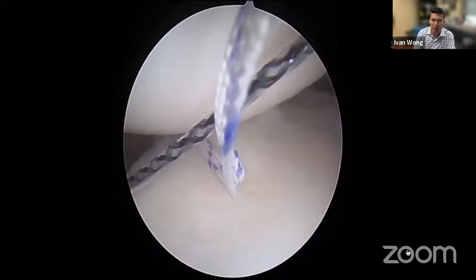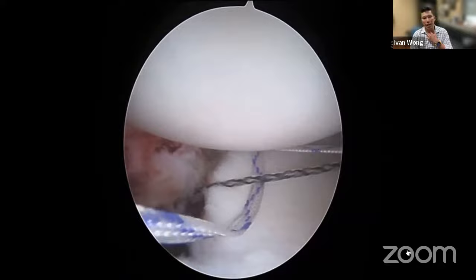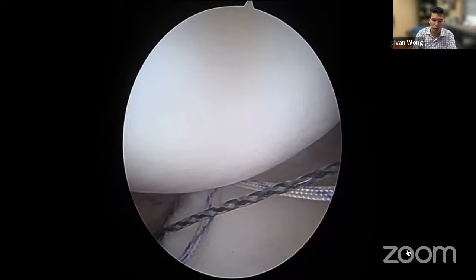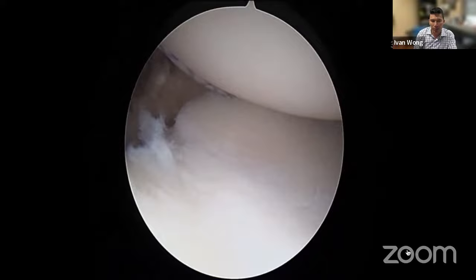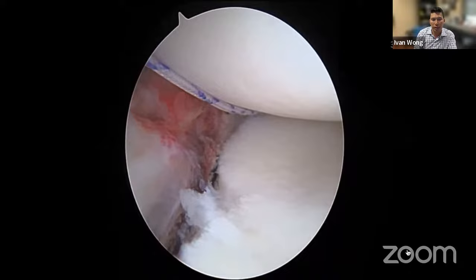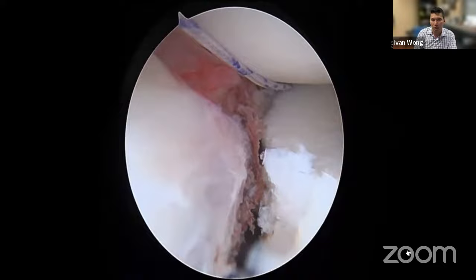We grab the suture out the posterior portal and shuttle it back through the capsulolabral complex. This technique means we don't have to guess how much tissue to grab for the Bankart repair — a common question with the traditional technique. We are grabbing exactly the amount of tissue dictated by the reduction achieved when we pull on the traction stitch. With the traction suture pulling inferiorly, the suture passes immediately underneath the capsulolabral complex at the junction with the muscle belly. I reduce the head to tie the knot, pulling on the traction stitch to ensure the tissue is shifted before tying.